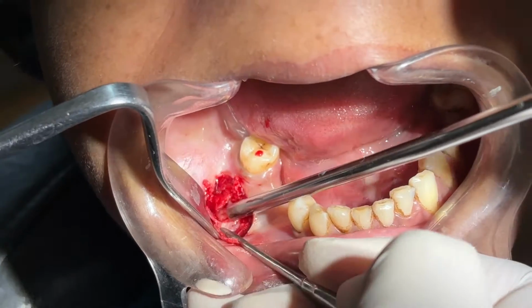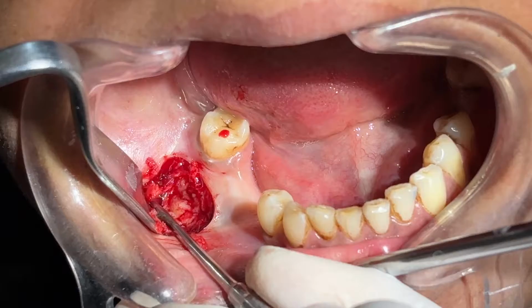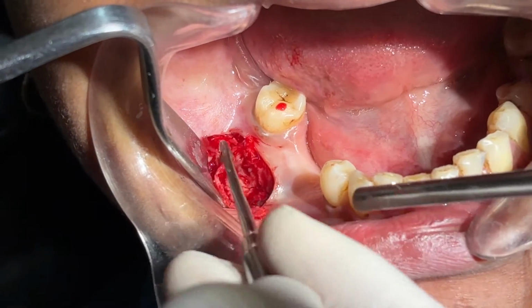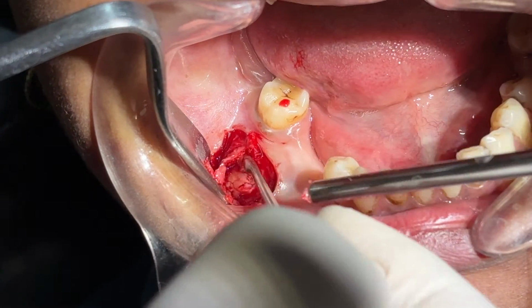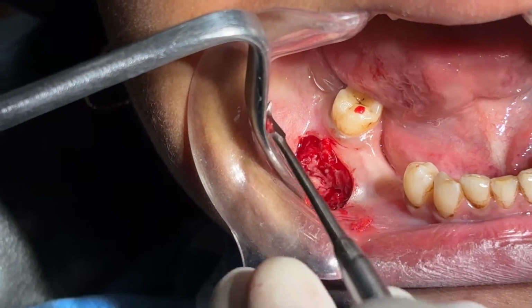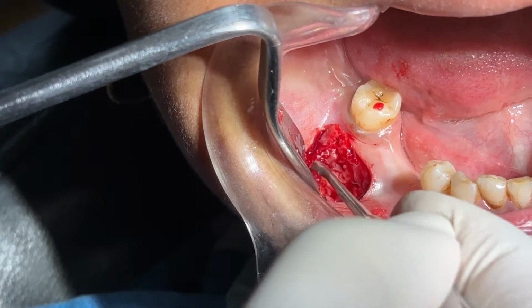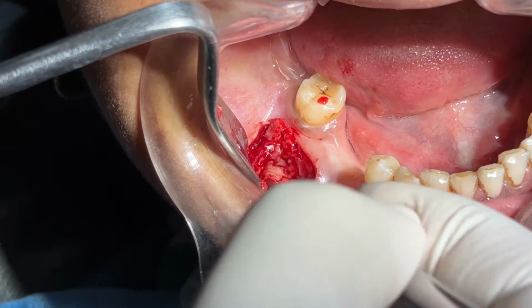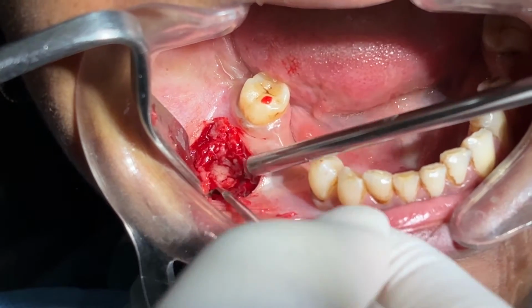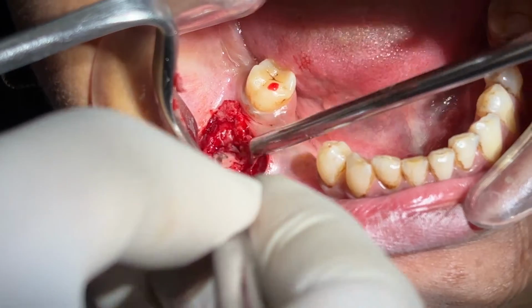Sometimes there is a hard bony structure that cannot be broken like this. Then you need to use a large round bar to make a hole, and through that hole you can take the biopsy. But now you can see this is thinning of the buccal cortical plate, and this is the tumorous mass. I will take a good amount of tissue using my blade. This is a glistening structure, this is the tumor.